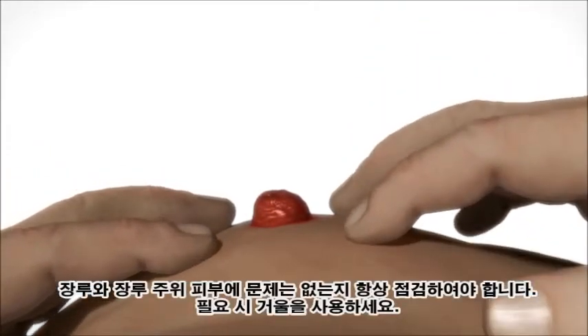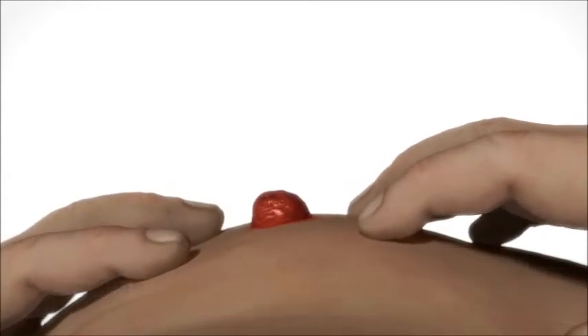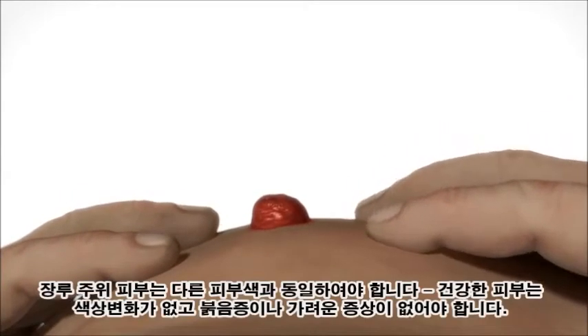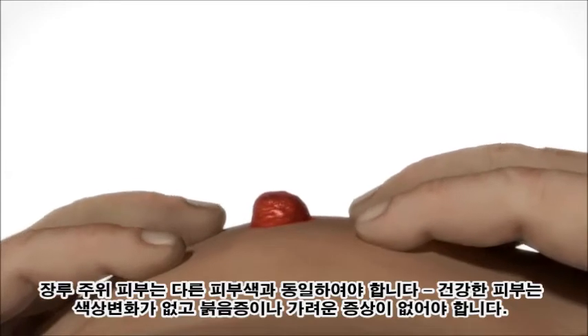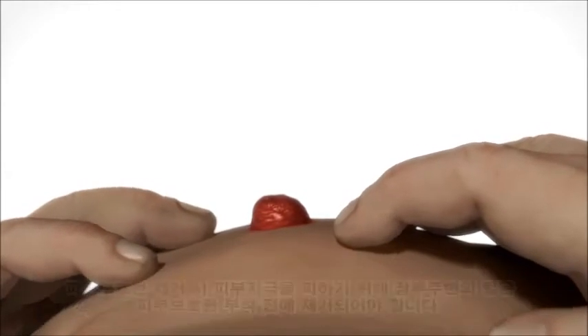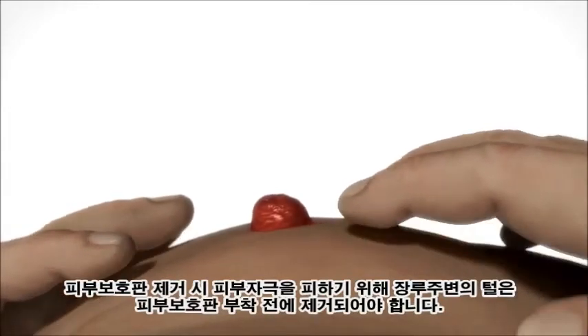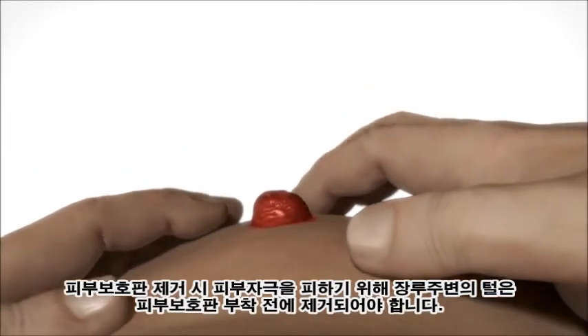Inspect the stoma and the peristomal skin for any problems. Use a mirror if necessary. The peristomal skin should look like the skin on the rest of the body — healthy with no discoloration or signs of irritation. Hairs in the area should be removed to avoid irritation of the hair follicles when the next adhesive is removed.